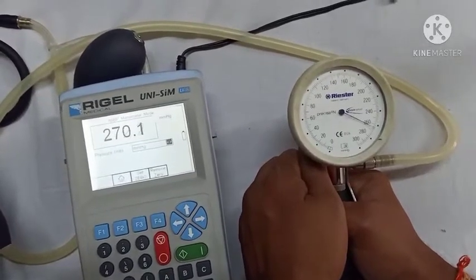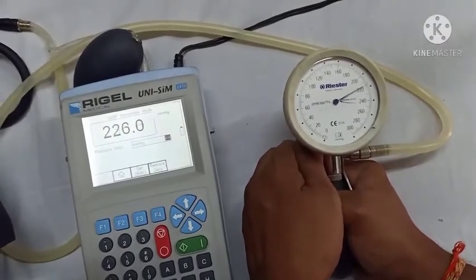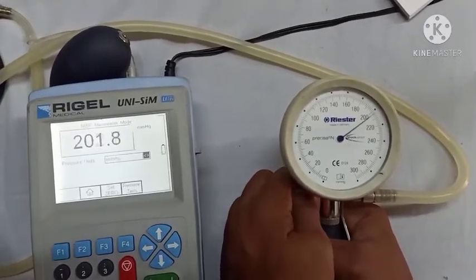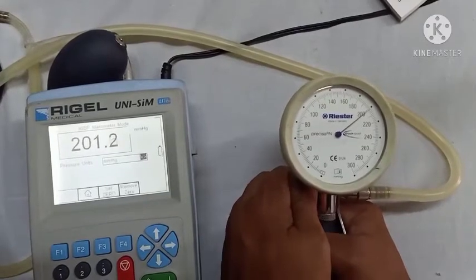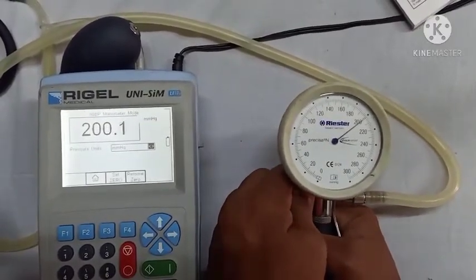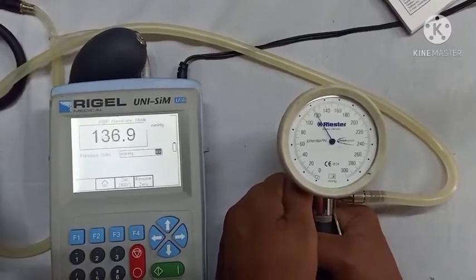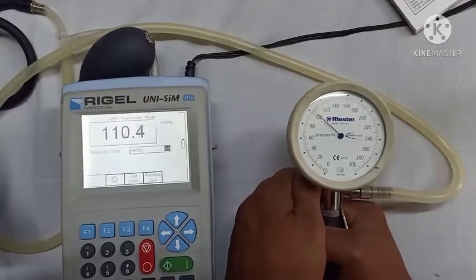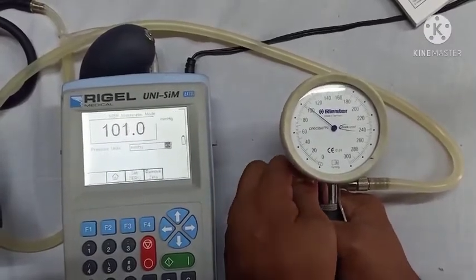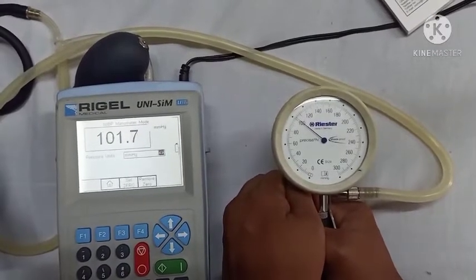Now, as you can see, we are releasing pressure by loosening the pressure release valve as the pressure decreases. We take the reading at 200 mmHg, then decrease to 100 mmHg and take the reading, then further decrease to 50 mmHg and take the reading at that point.